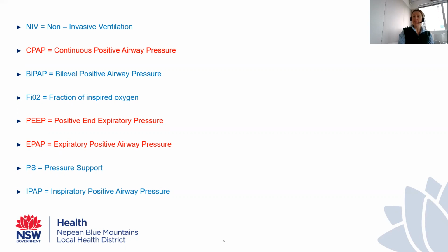The ones that I've highlighted there in red, so CPAP, PEEP, and EPAP, are all terms that mean the same thing. So yes, they're different words, but they are interchangeable and they all mean a pressure that is felt at the end of expiration. So it's a positive pressure that we're applying at the end of expiration.